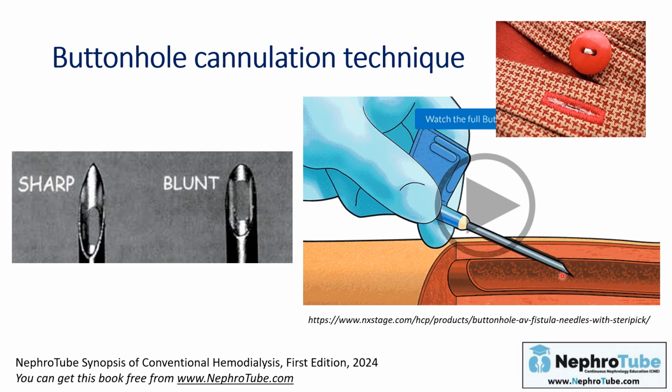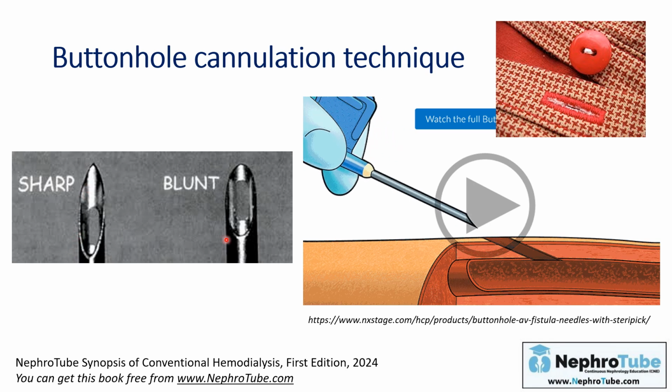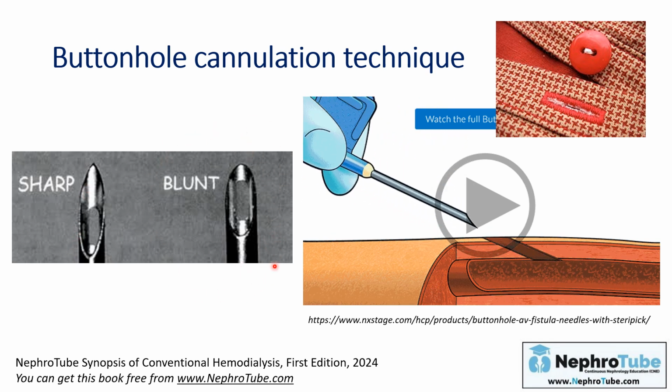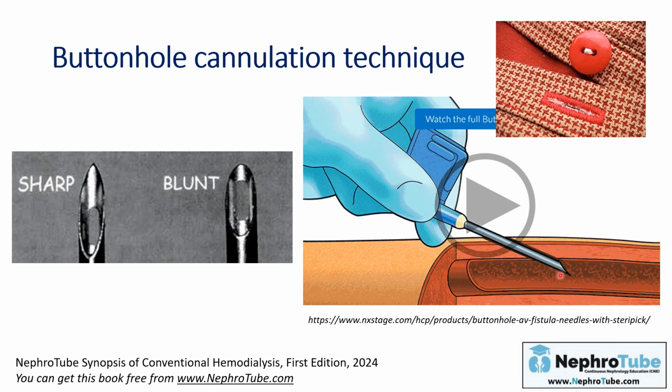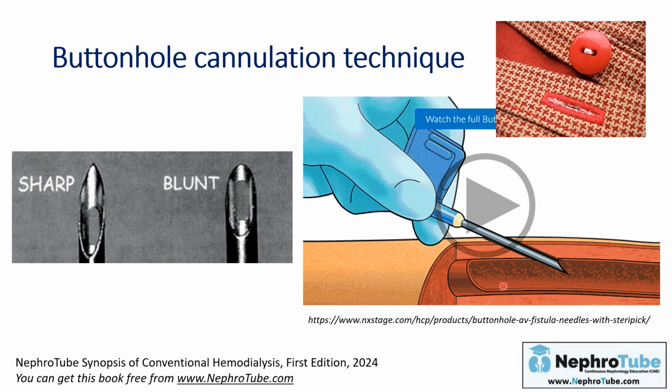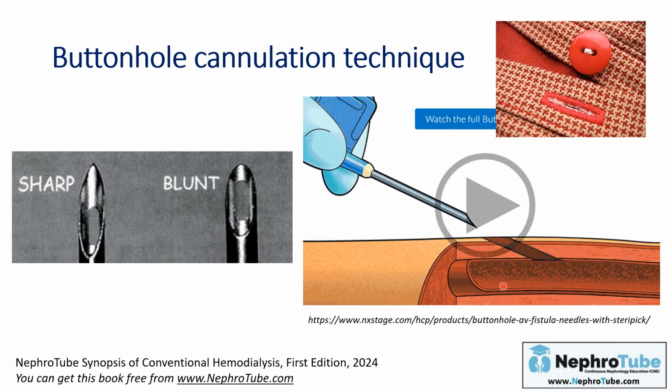After the creation of this tract by the sharp needle, you can now use the blunt needle, this blunt needle, to prevent severe injury to the wall of the vessel and prevent the formation of the aneurysm.